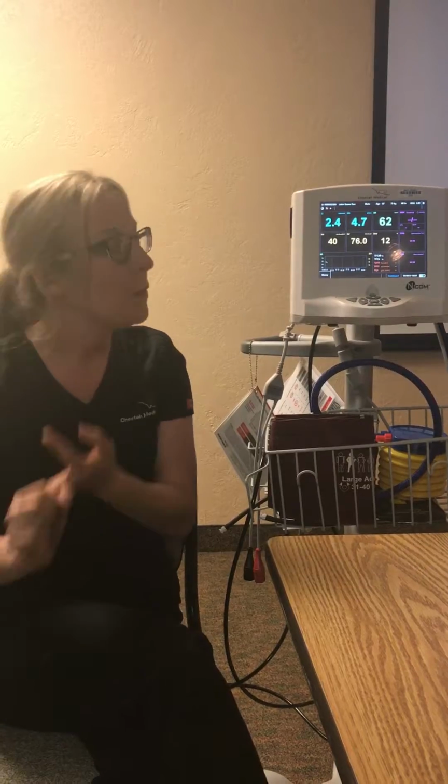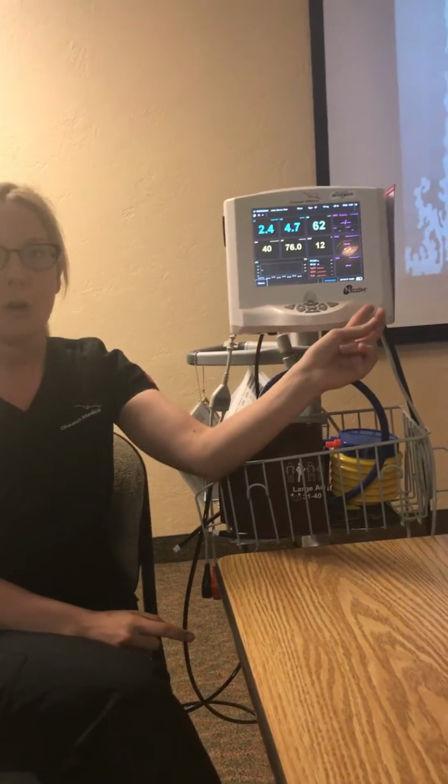How do you know when your patient is overconstricted? Once you see no pulses, black toes, poor urine output, right? The damage is already done. We will see it by typing the MAP and having it show up on here. So for patients on pressors, you can enter the MAP and do that as you're titrating up or down on your pressors to make sure we're not overconstricted.